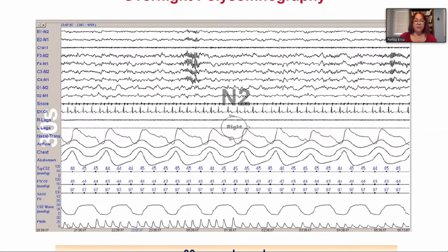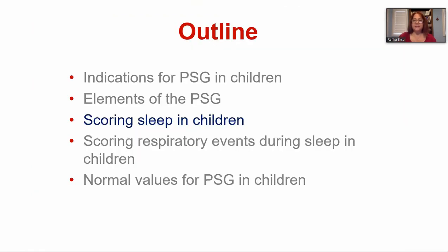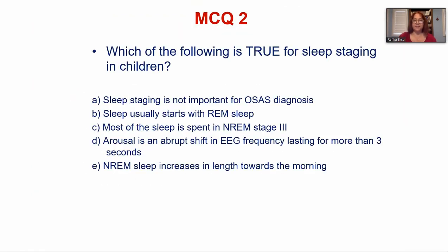And it's important, especially in children, I find, to have a plethysmography signal for the pulse oximetry. So if it's not picking up and you don't have a good signal of the saturation, you're not incorrectly saying that the child is having these desaturations.